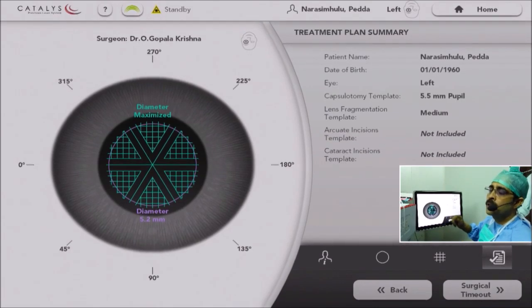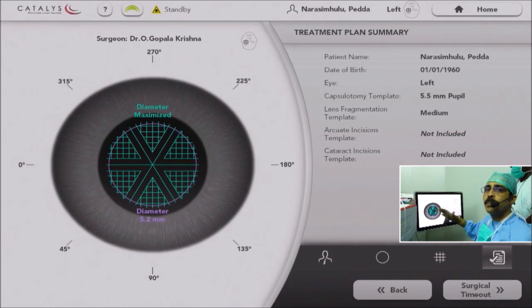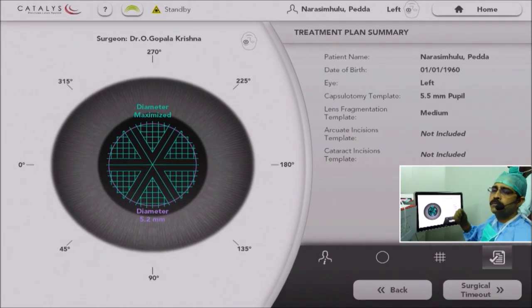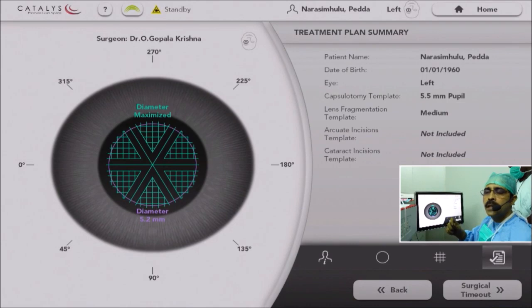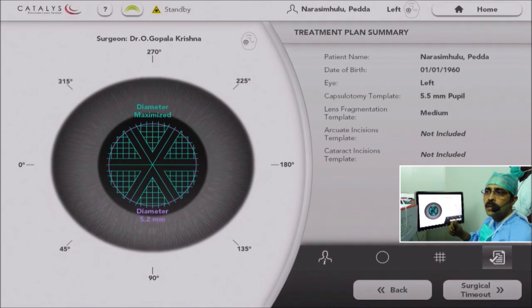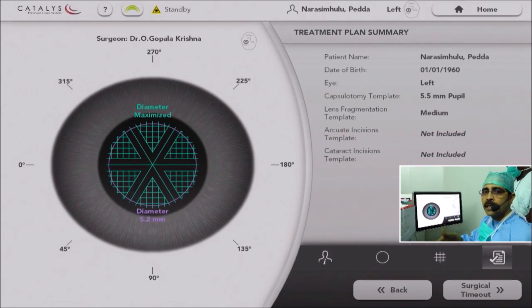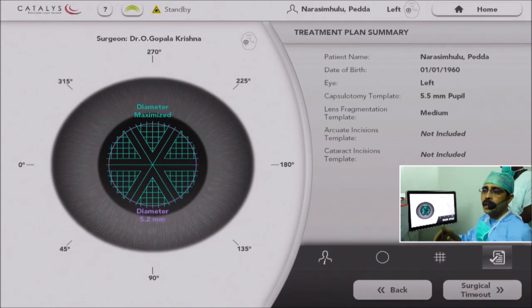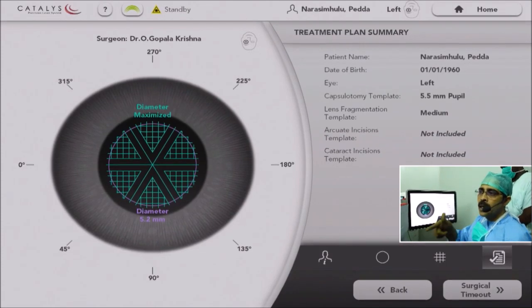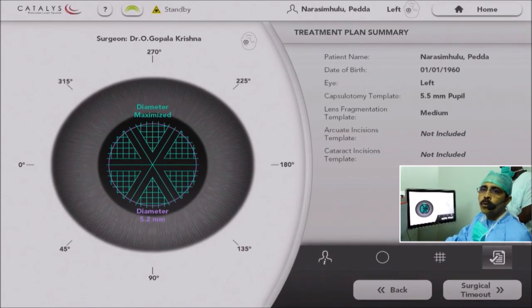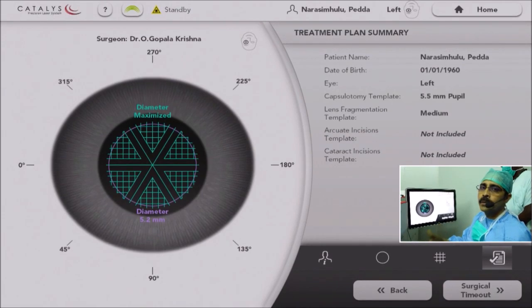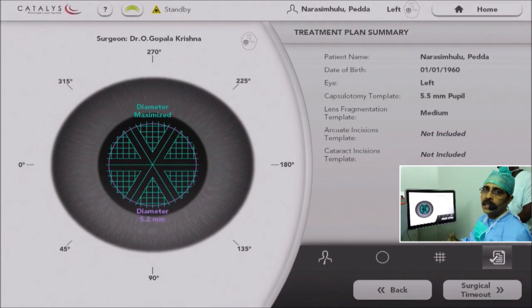The cataract incision I am also not using here. Most surgeons are not using the cataract incision part of it. There are some issues: if there is too much of an arcuate element, the laser may not give exact corneal incisions. Also, because this is a clean room — not a sterile room — my concern is I don't want to do a corneal incision here in the non-sterile clean room. That is the reason why I am not doing cataract incisions here.